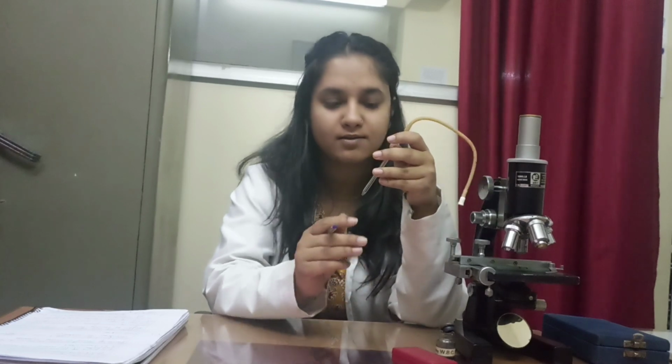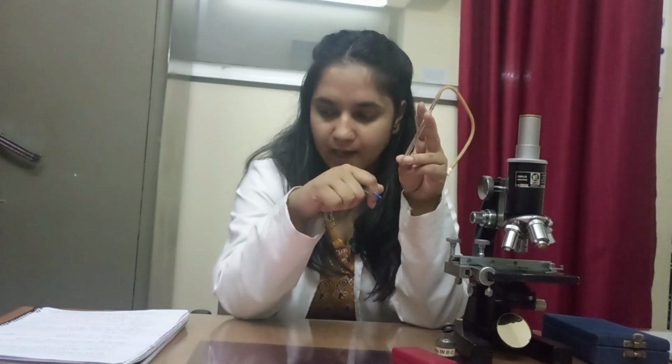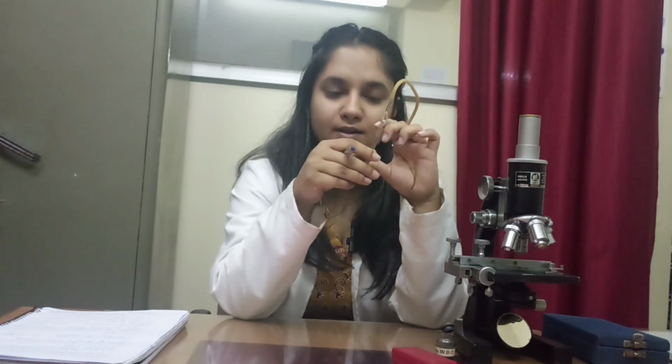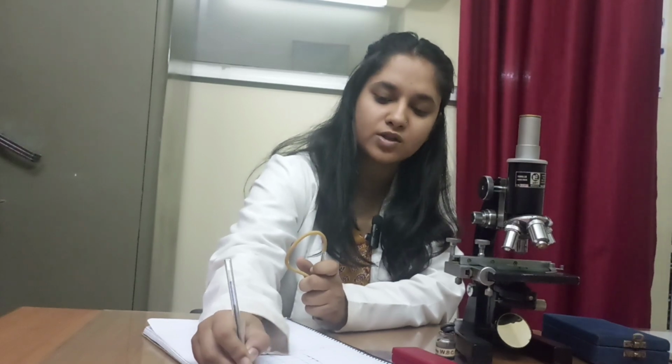So 1.0 part of the fluid present in the stem of the pipette does not mix with the blood and it should be discarded. So 0.5 part of the blood mixes with 9.5 parts of the fluid to make it 10 parts. Therefore, we can calculate the dilution factor as 10 by 0.5. 10 by 0.5 means the dilution factor is 20 times. The effective dilution factor is 20 times.